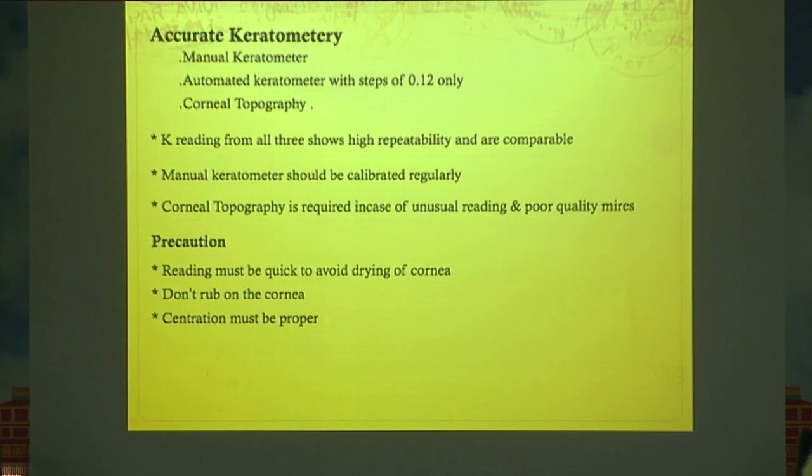Precaution must be taken that the reading is quick to avoid corneal drying, because most of the machines use the tear film for obtaining the keratometry values. Don't rub the cornea beforehand. Centration must be proper to obtain the best result.